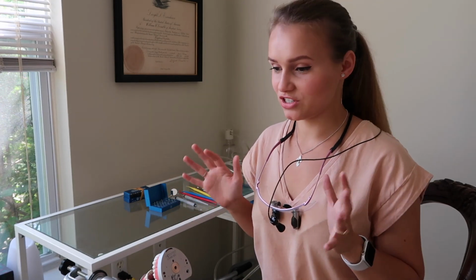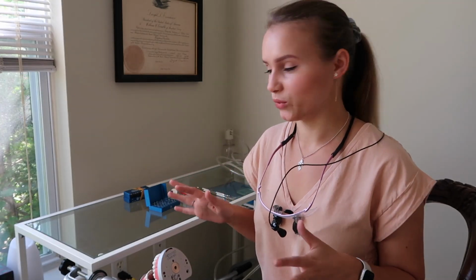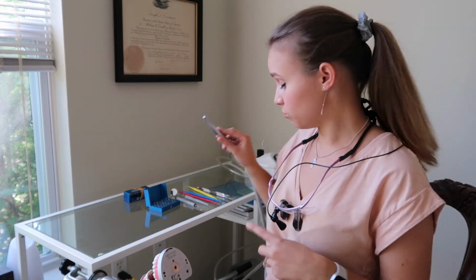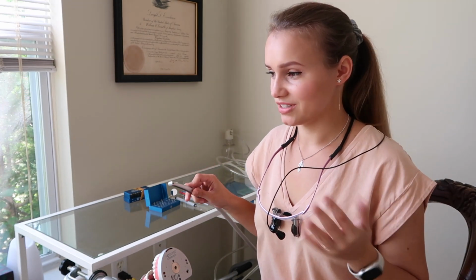You may remember that I mentioned before that the compressor is very loud. It is, but temporarily. So right now it's quiet, but when it needs to pick up air, when it collects and sucks in air, it makes a lot of noise. It does it from time to time, and it actually makes me jump because it just abruptly starts making really loud noise. But when you just drill, most of the time it just makes the sound of your handpiece. When you drill for a long time, because it has a small tank, it really starts being very noisy. It scares my pets, it scares my husband, it scares me, so buyer beware, it makes noise.